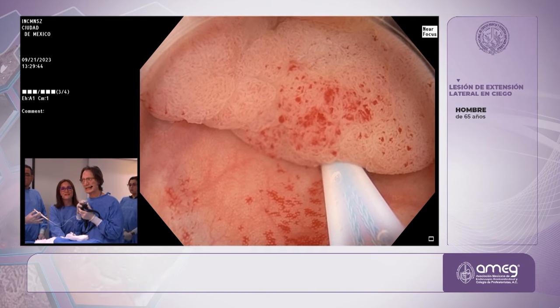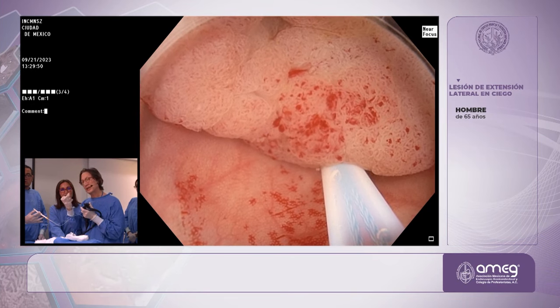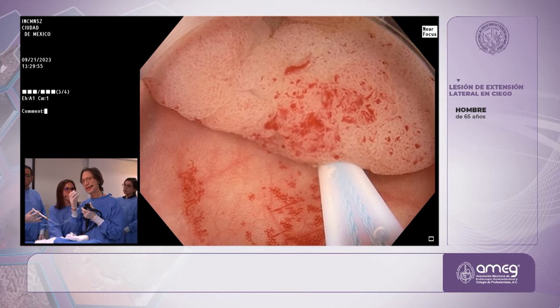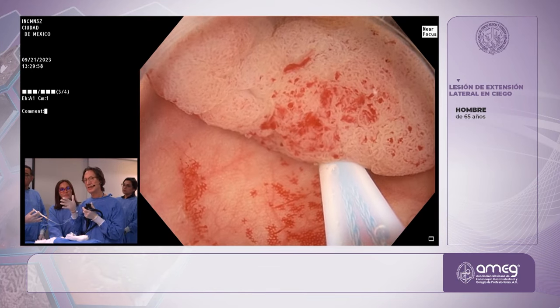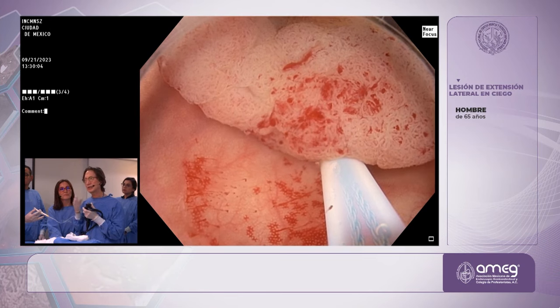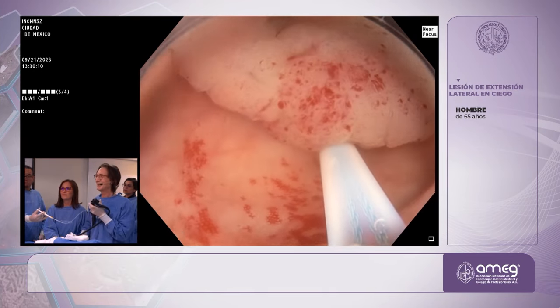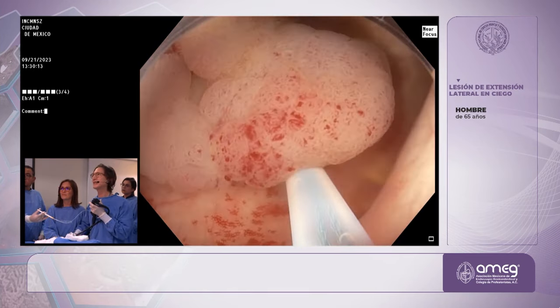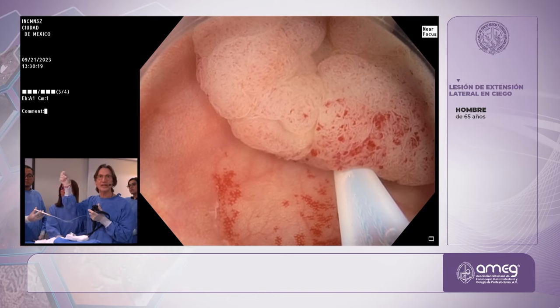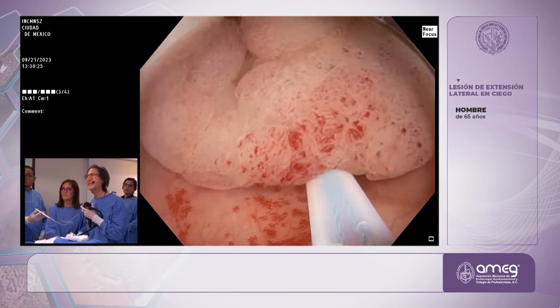Now, the key when you resect this, I use auto cut, but if the nurse just closes, it'll just cut right through. So the idea is to give it some time and let the snare cut through it. But I'm stepping on the yellow pedal the whole time, so I'm getting enough coag current. And you can start with a little bit of coag too. But before I do that, I'm going to do the rotisserie. And this is the rotisserie. See how I'm moving this around? And I'm looking. Sometimes I'll do diathermic dots on the outside just to be sure that I've got the whole circumference. But it wasn't necessary in this case.